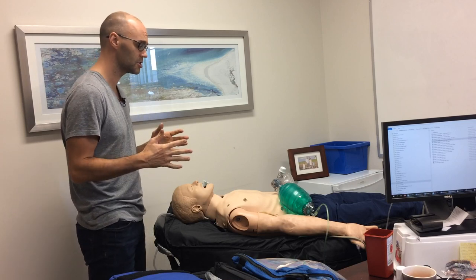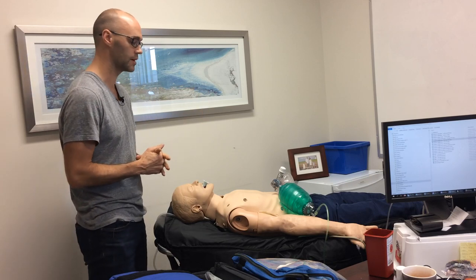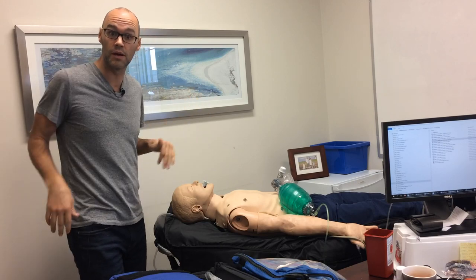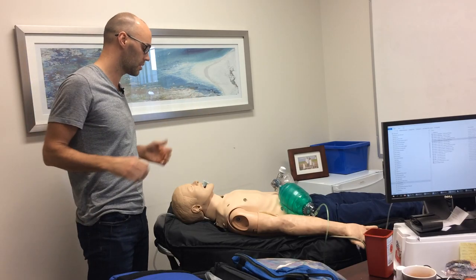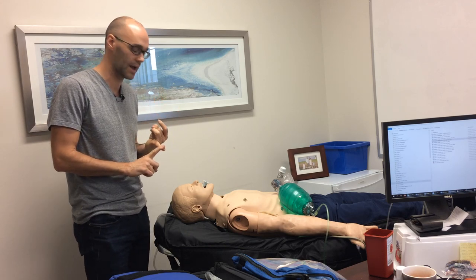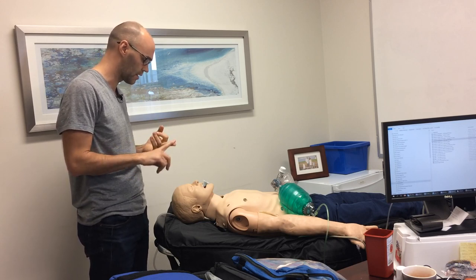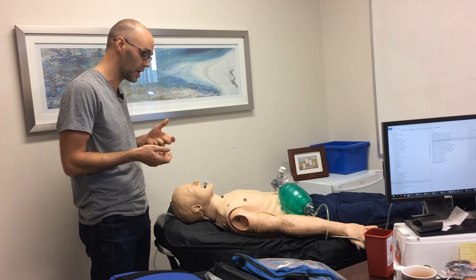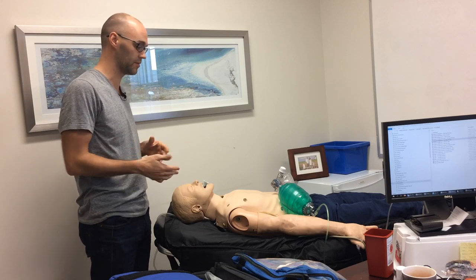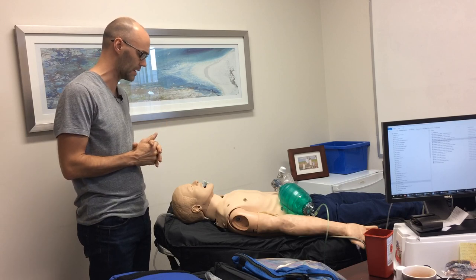Once your patient's oxygenating well, or you've done everything that you could do to oxygenate them besides intubation, then we're going to identify the indications for intubation. We want to be thoughtful: does the patient have inadequate gas exchange? Are they failing to protect their airway? Is there a need to obtain and maintain their airway in the case of some sort of obstruction in their upper airway or something where you need to capture their airway now?